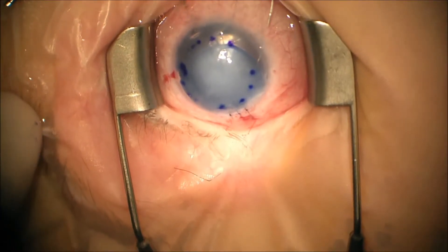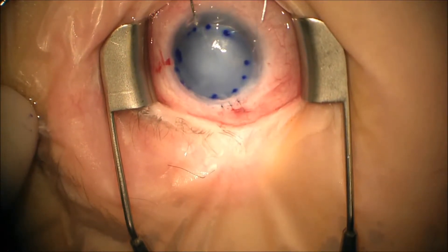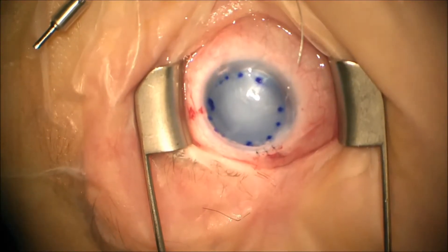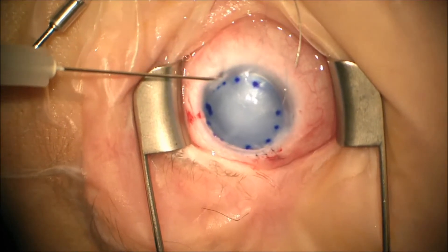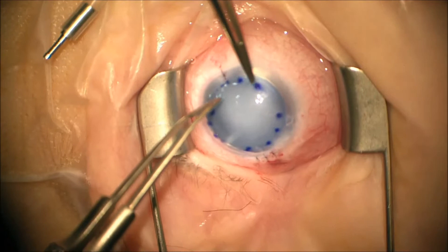The graft is still a little decentered, so we're going back in to properly center it. Once it's all centered, we cut the CTC6 needles off the suture and tie a knot — not too tight.